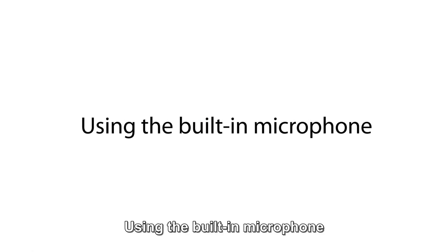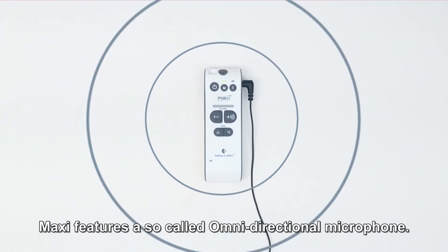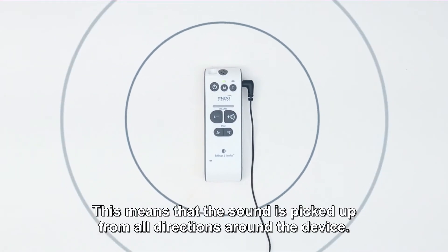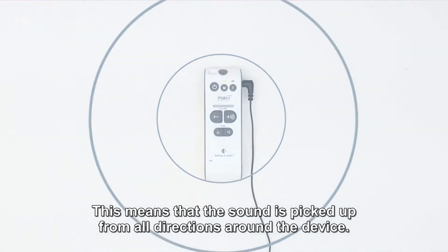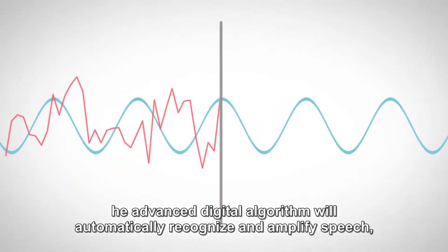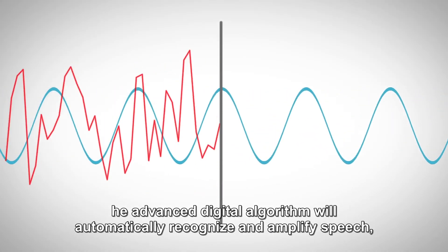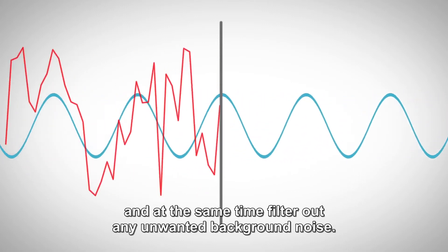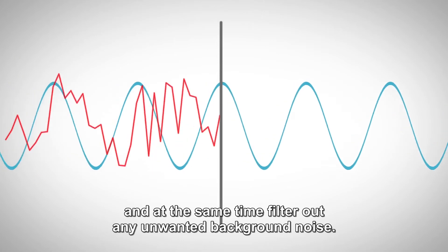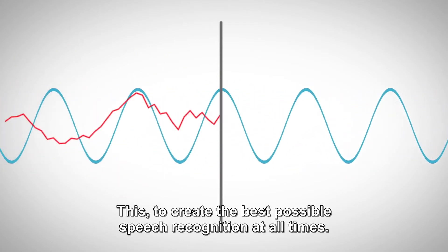Using the built-in microphone. Maxi features a so-called omnidirectional microphone. This means that the sound is picked up from all directions around the device. The advanced digital algorithm will automatically recognize and amplify speech, and at the same time filter out any unwanted background noise — to create the best possible speech recognition at all times.